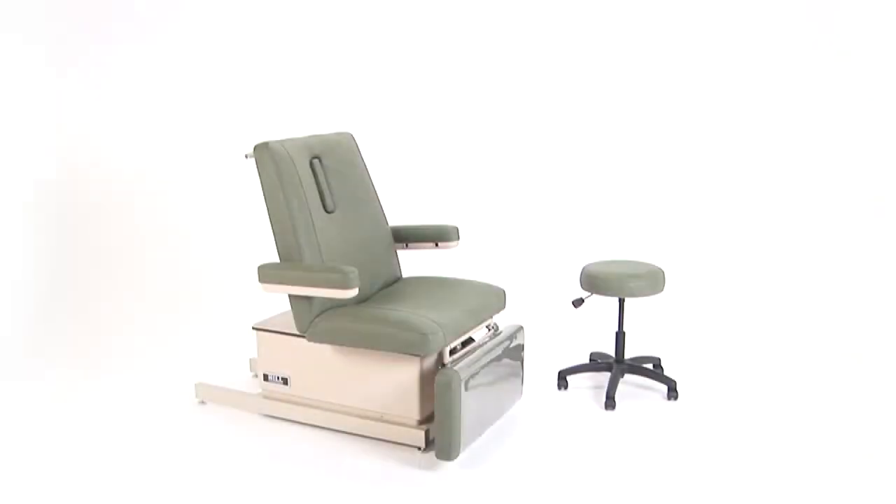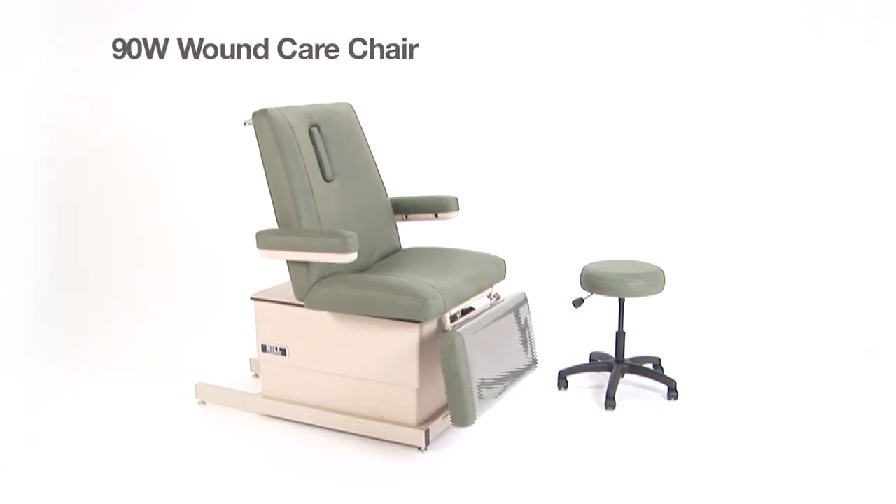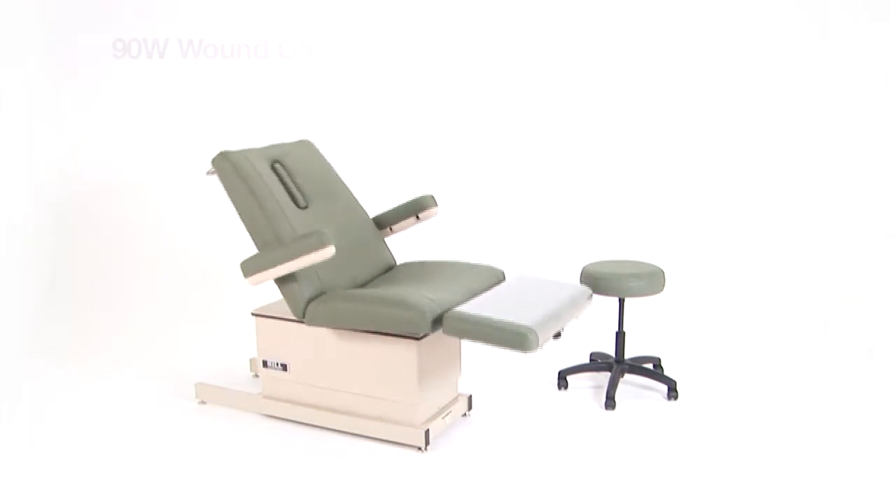Working closely with consultants in the wound care field, Hill Laboratories has developed the 90W Wound Care Chair with special features that are designed to meet the unique needs of wound care facilities.